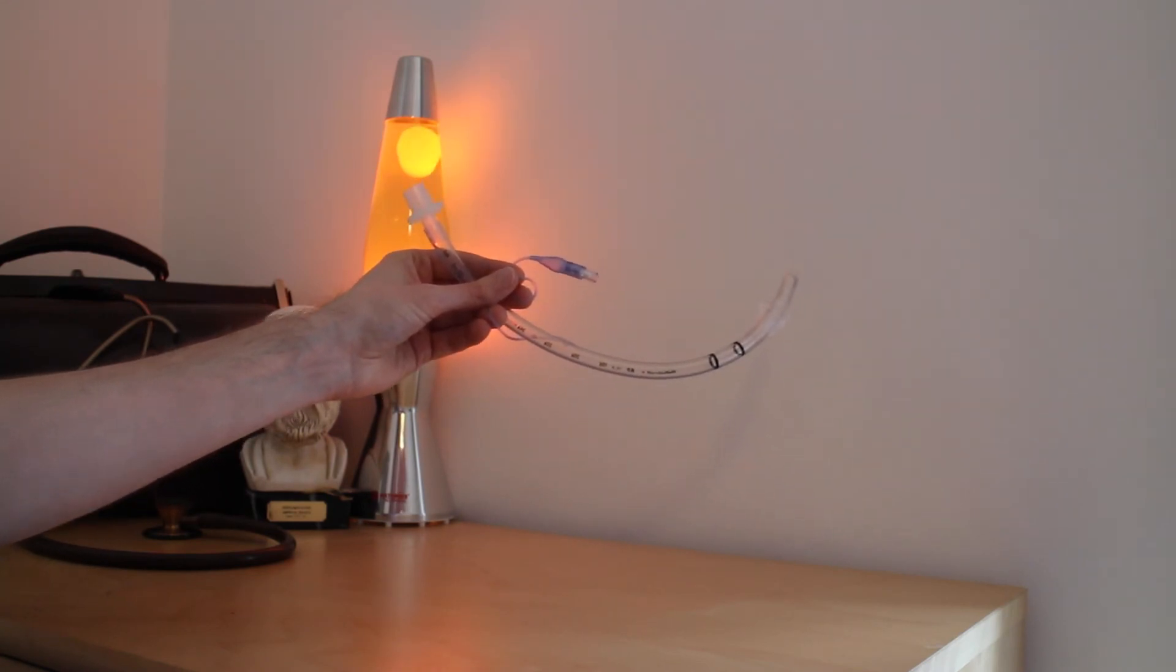This is an ET tube designed to provide a definitive airway, hence the cuff. However, it is possible that a patient may aspirate. This means that the stomach contents is vomited or regurgitated and then it passes into the lungs.